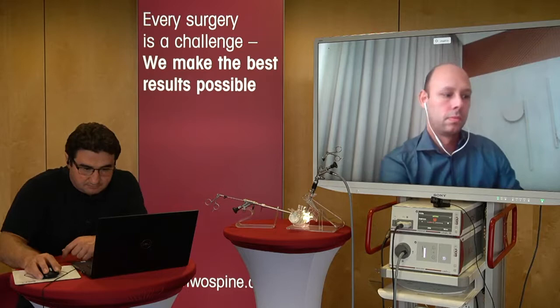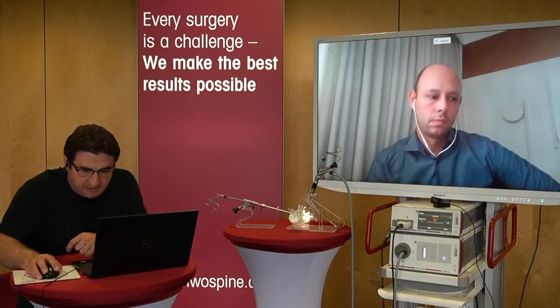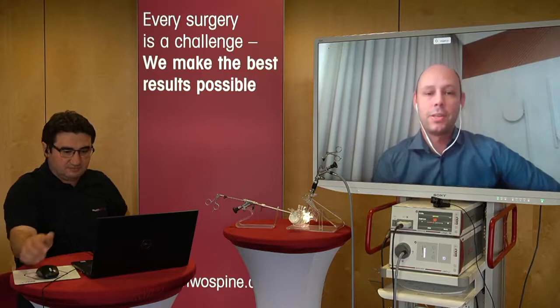Okay. Another question: what is the rate of postoperative dysesthesia following lumbar transforaminal decompression? Yeah, this is a good question. You can have less dysesthesia in the transforaminal approach. You don't need to put the work sleeve directly into the foramen. You can use the extraforaminal approach to have less dysesthesia. I use the extraforaminal approach a lot for disc herniation. It is very good. And at the time of surgery, you don't need to mobilize the work sleeve a lot. You don't need to burn inside the root. There are some tips and tricks in the transforaminal approach to reduce dysesthesia.